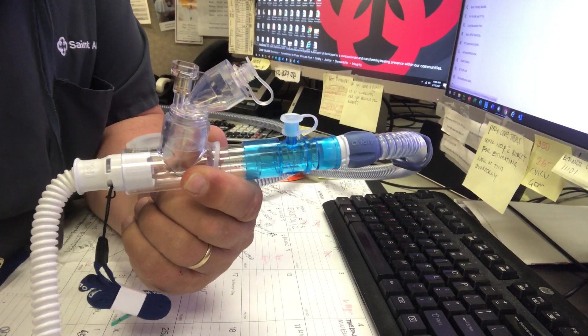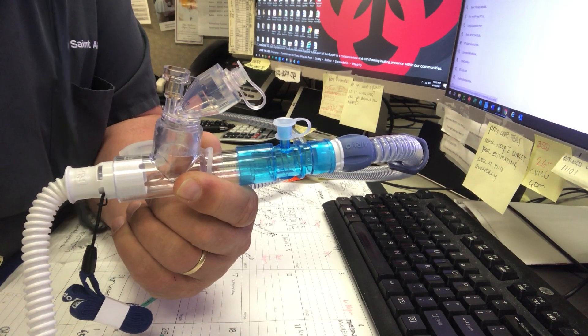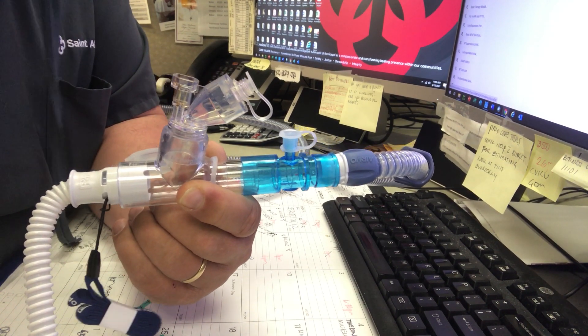So it should look like this. The only other thing on operation — and this was suggested by Aerogen — is that the flow will be no higher than 20 liters per minute while you're delivering the med.